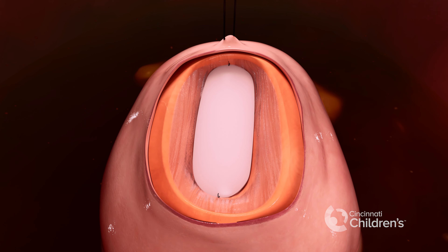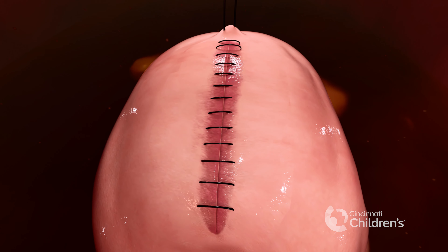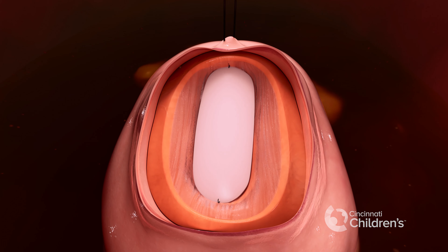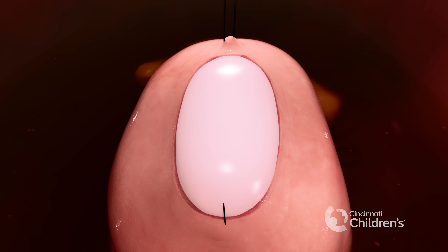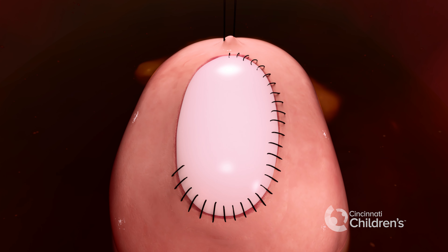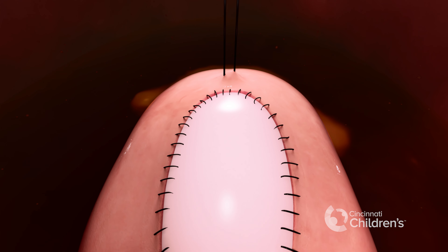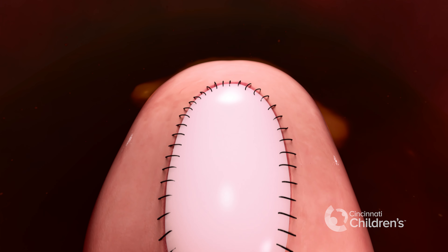We then close the skin over the spinal defect using dissolvable sutures when the baby has enough skin to do so. If the defect is too large and we are not able to close the skin, we use a skin patch forming a watertight closure. The stabilization stitch is removed, and the repair is now complete.